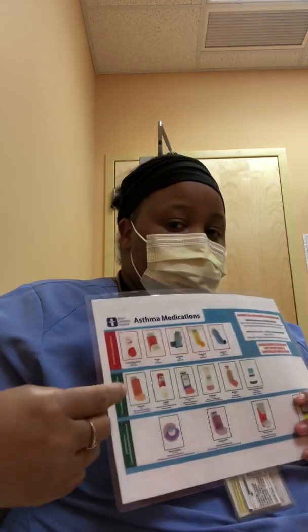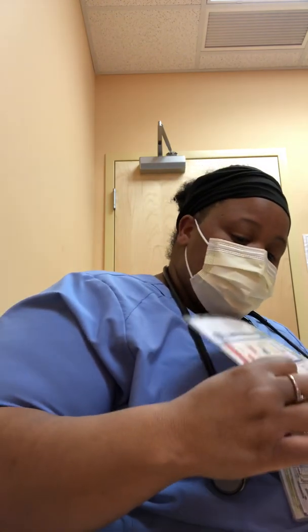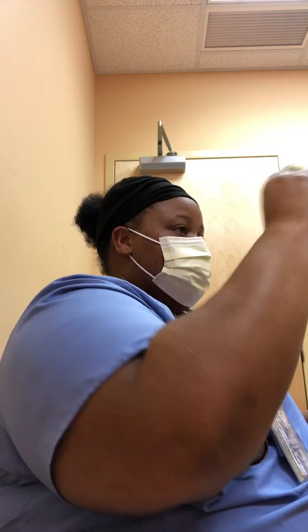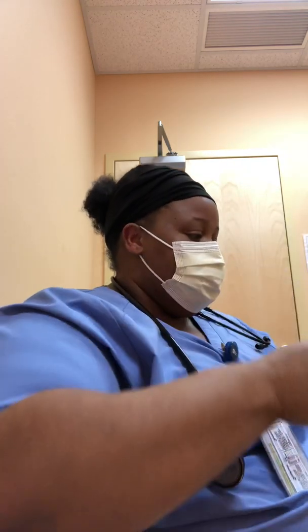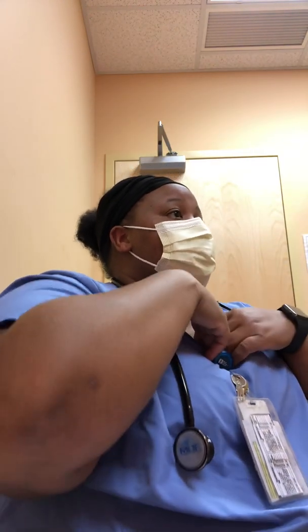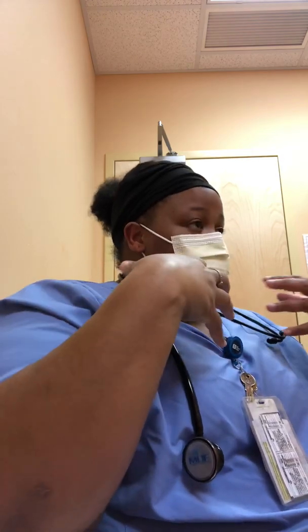All right, the Flovent is this orange inhaler that you're going to get right here. It is a controller med. It prevents your airway from going to that picture where your airways are like this. We want them like this, open and able for air and blood to move through. It's a steroid, so it does take down some inflammation. Most of the questions that I get: oh, it's a steroid, it's going to make me fat, it's going to bulk me up. You're not taking an oral steroid, this is an inhaled steroid. It's going to go straight to the place that it needs to go for an effective result that's going to open up your lungs or open up your airways.